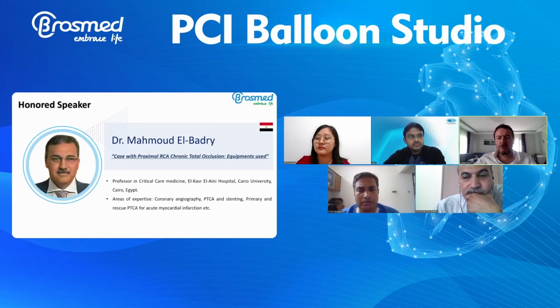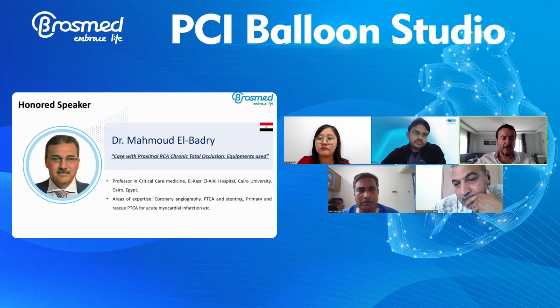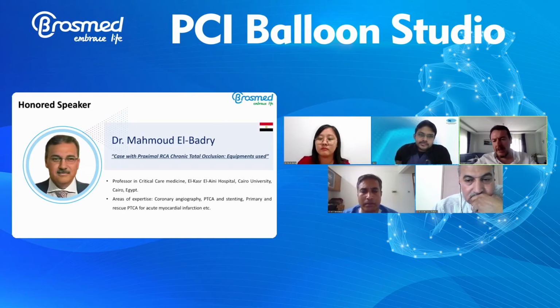The 1.0 balloon, the CTO balloon, is fascinating. I have also used the regular balloons, uncrossable CTO balloons, and septal pre-dilations, and Artimes helped me a lot. If Artimes does not go, I have not seen any other go as well.